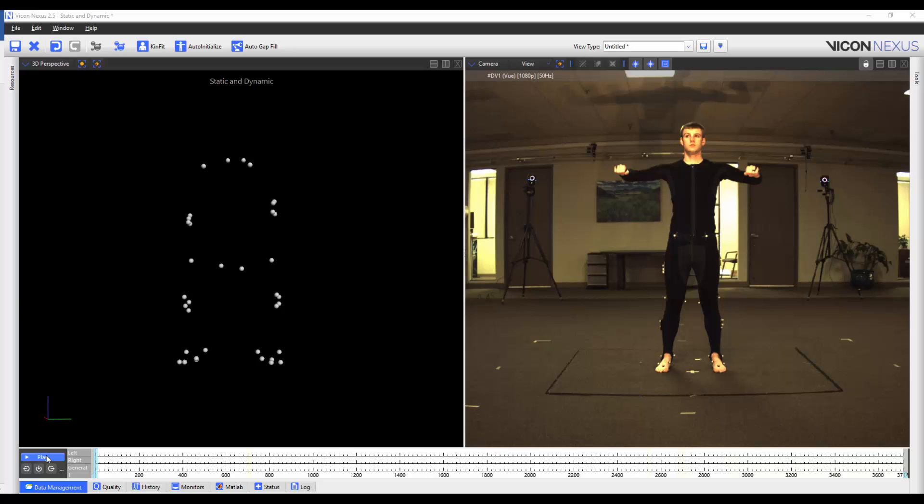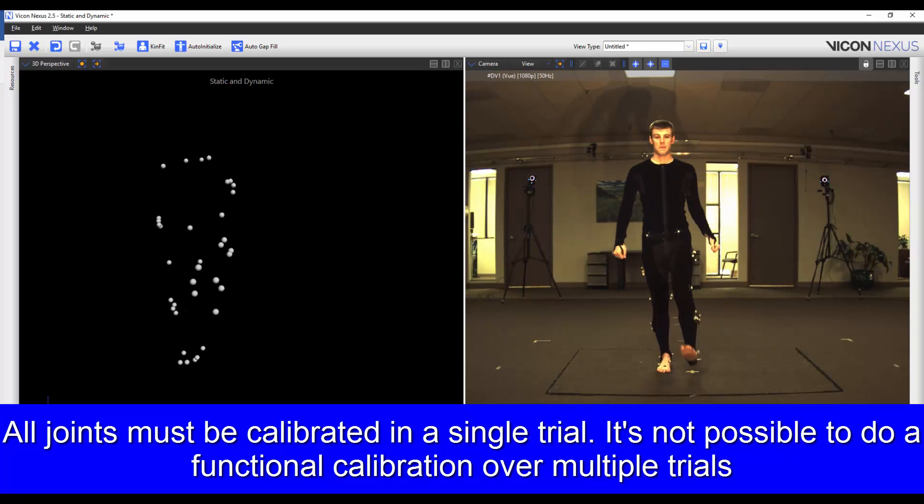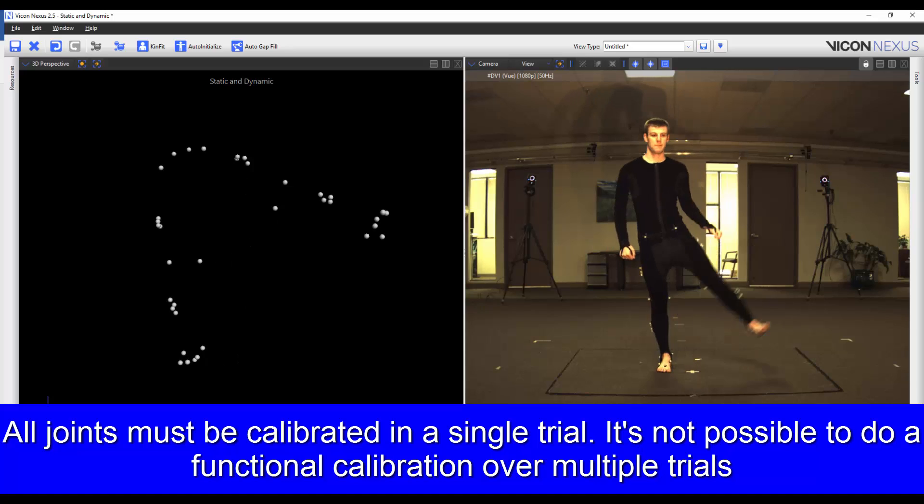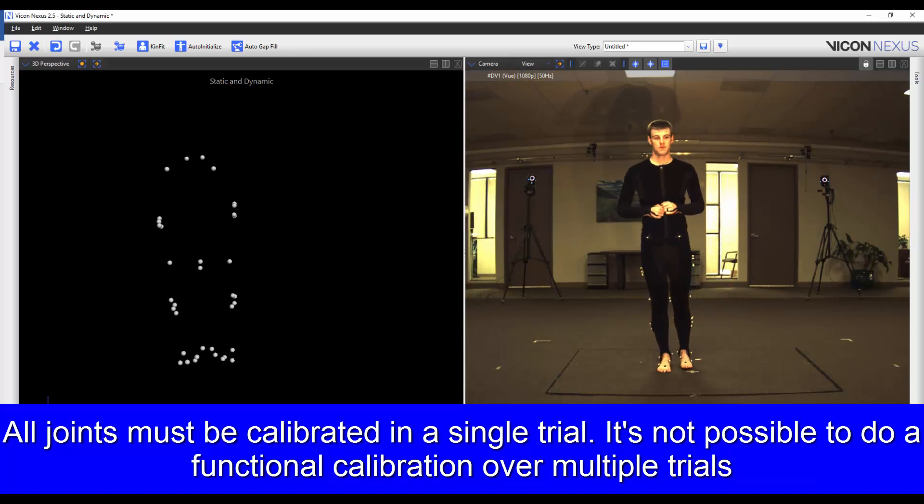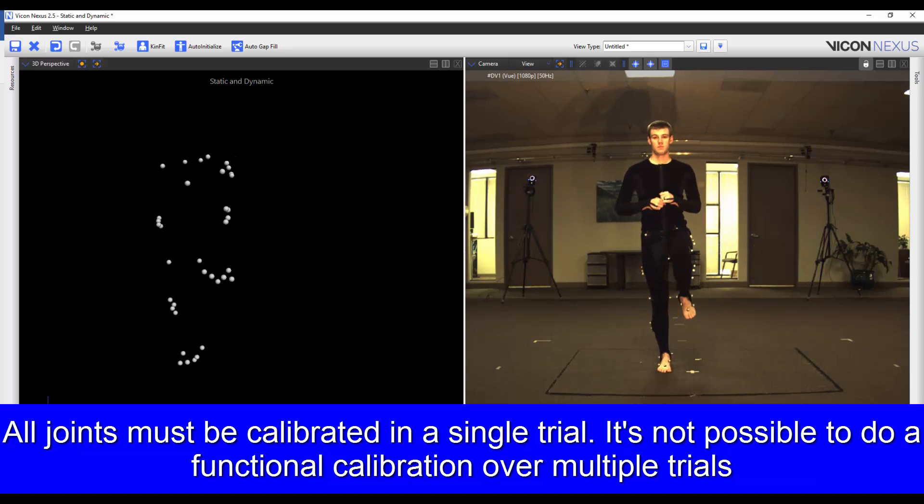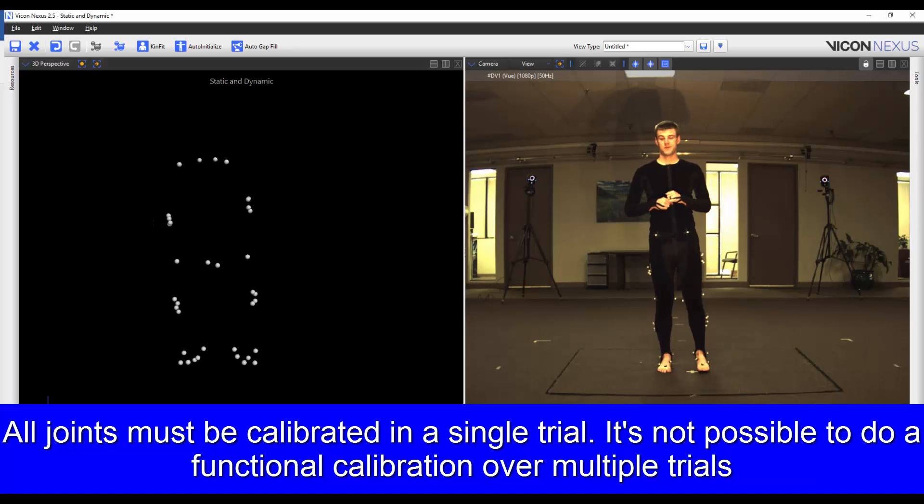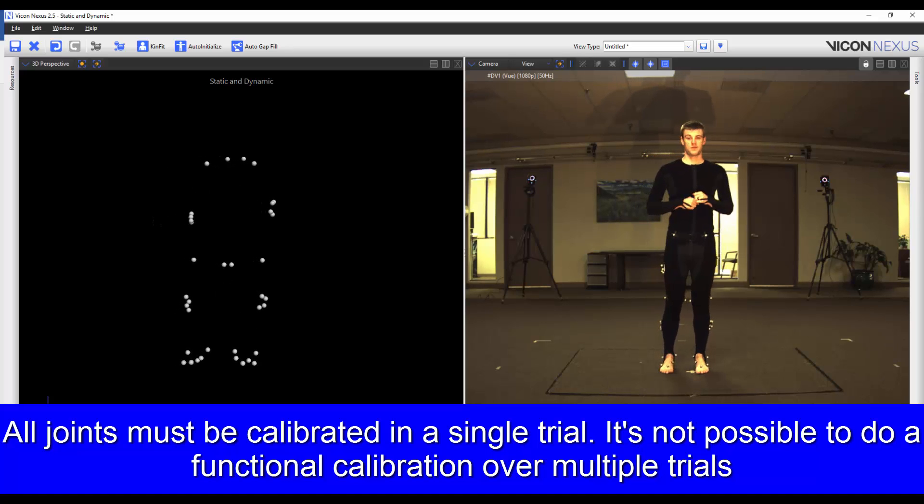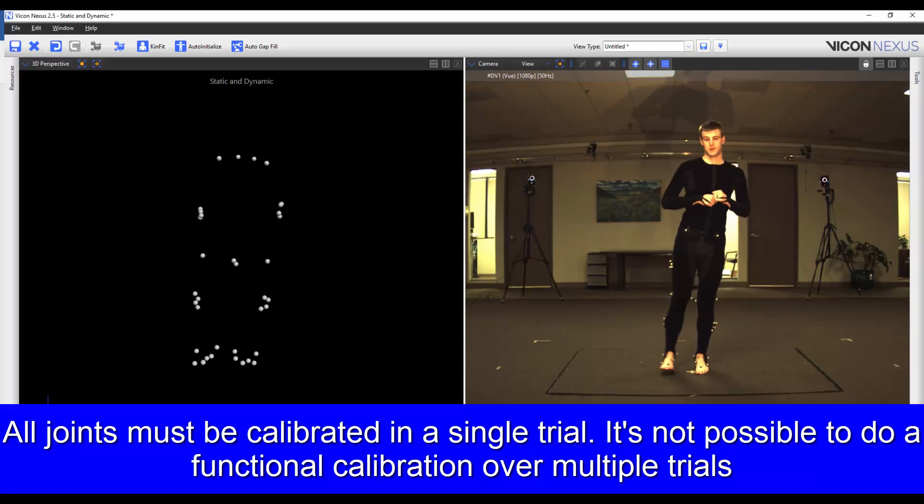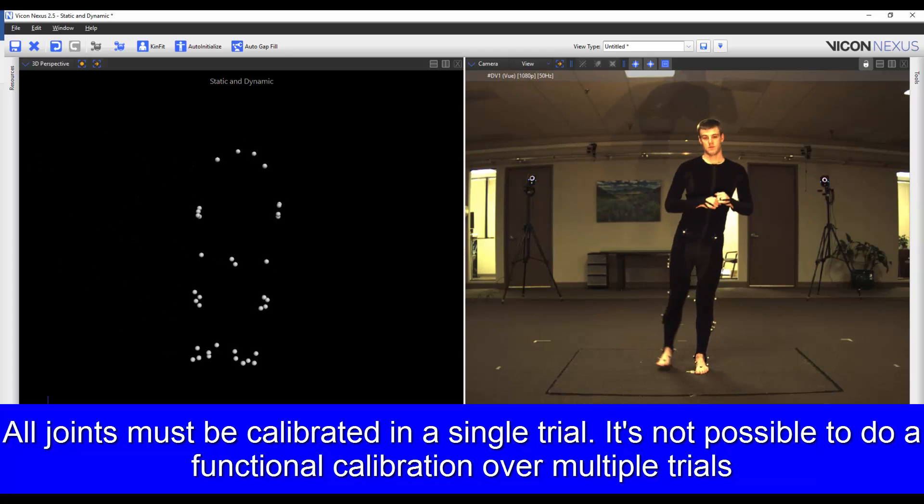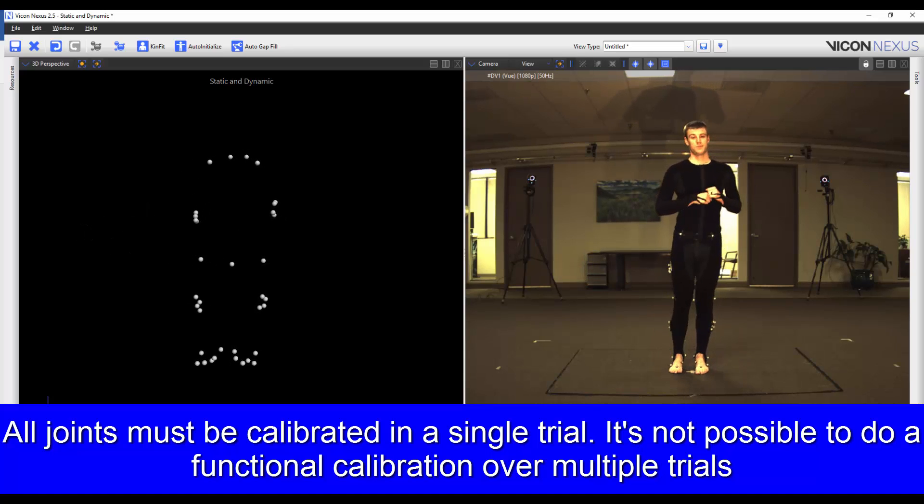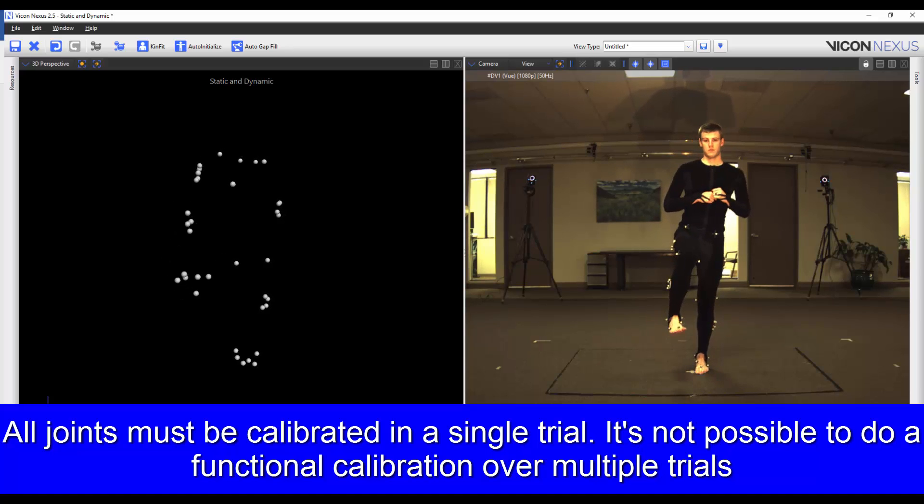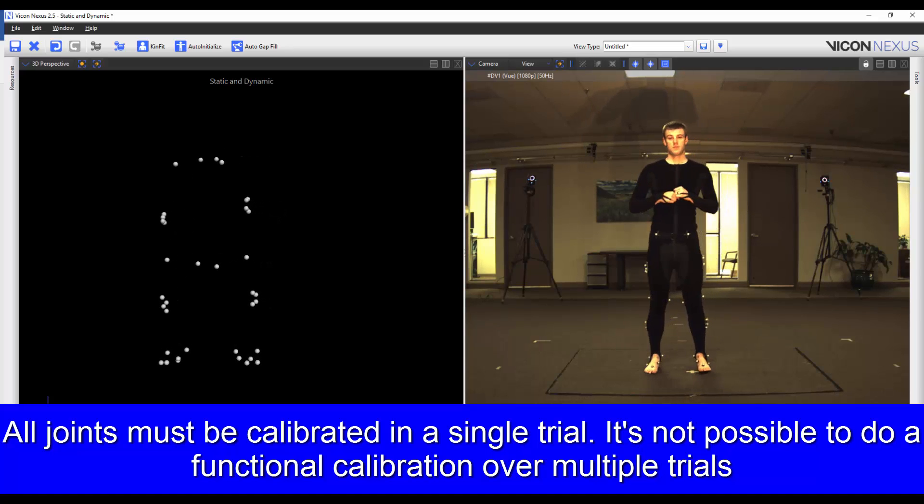I've captured a calibration trial where my subject is first standing in the base pose. Then he moves through a range of motion where he's performing a star pattern with the hips, he flexes and extends the knees and rotates the ankle joints. He repeats the process on the other leg. Finally, he returns to the base pose.